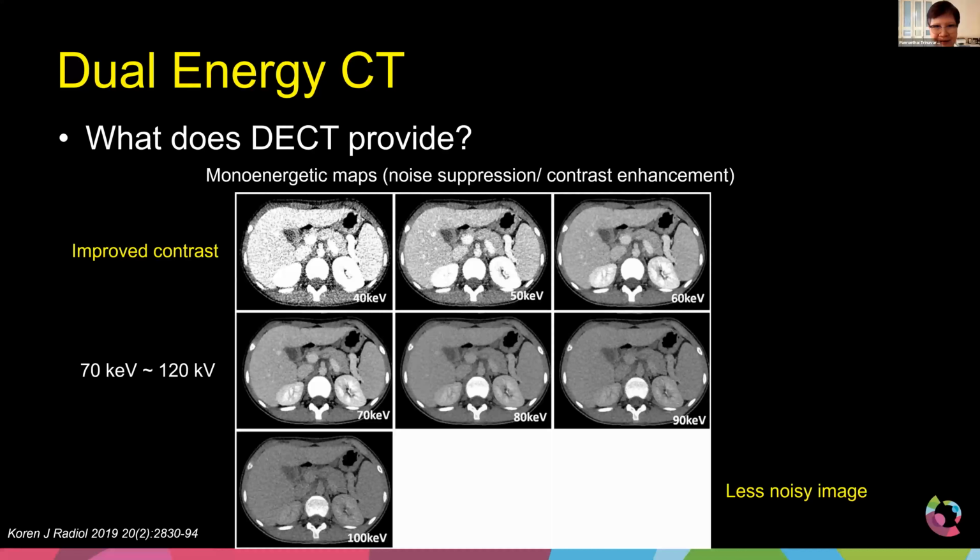And I think there's a question from the audience. Okay. Let's see. There is a question about the difference between monoenergetic and monochromatic images. Can you explain the difference between those in depth to clarify the clinical usefulness of these two definitions?